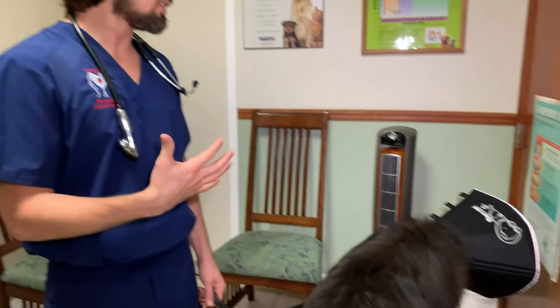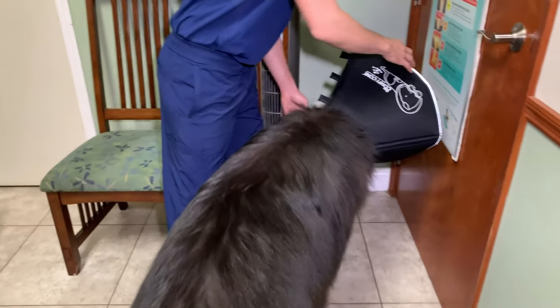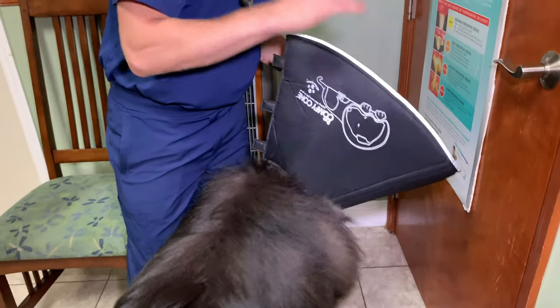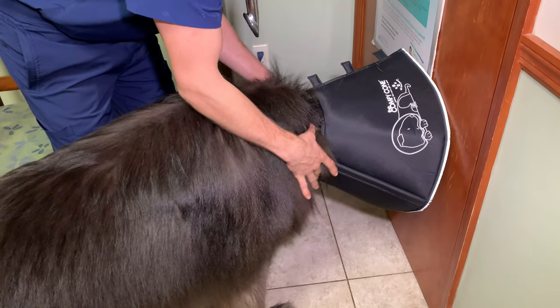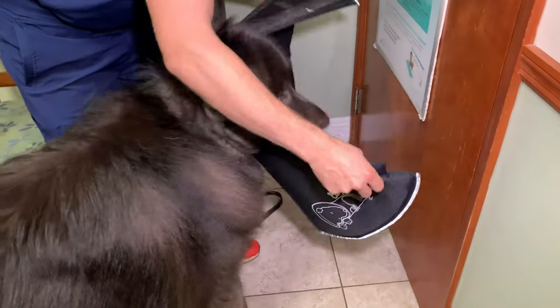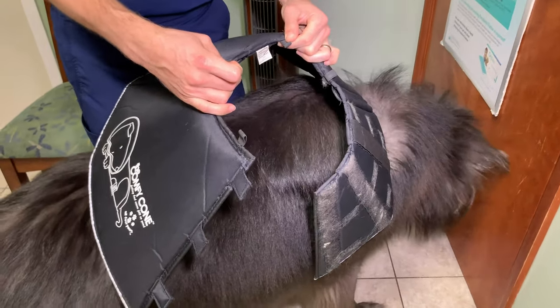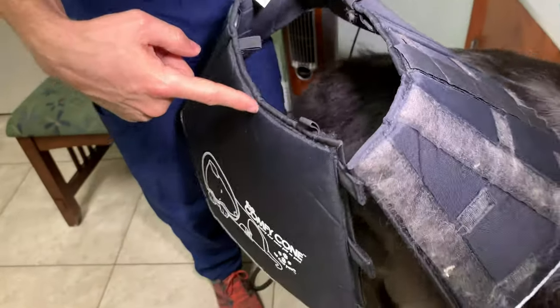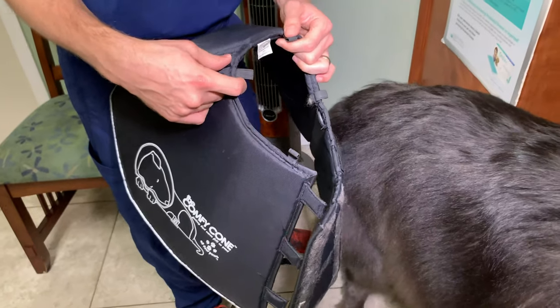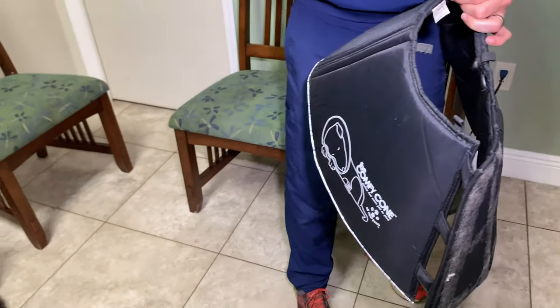One of the main topics of this video is how the cone fits. When you have these kinds of cones, there are two kinds of fit. First is going to be around the neck. What you'll notice is on these cones they have belt loops. So even if the cone is loose around the neck, typically what you can do is feed a collar through here, or even feed some sort of shoelace or something like that, that will go ahead and prevent it from sliding off the neck.